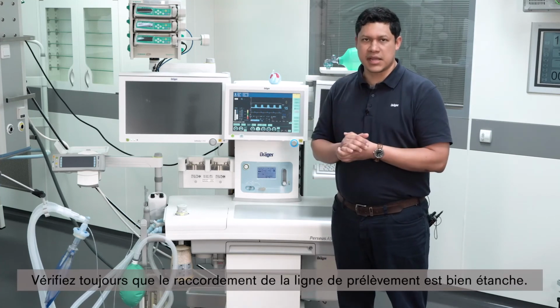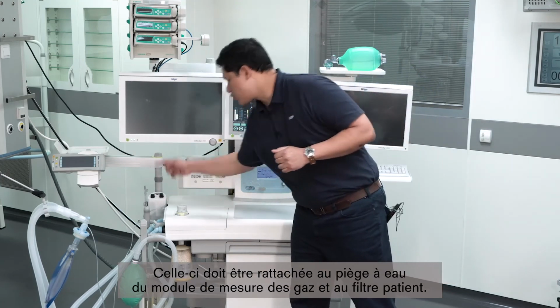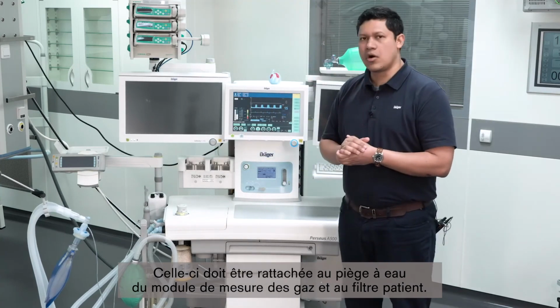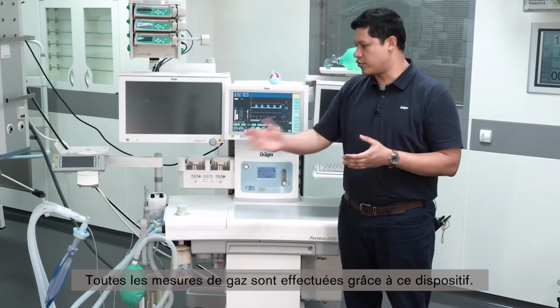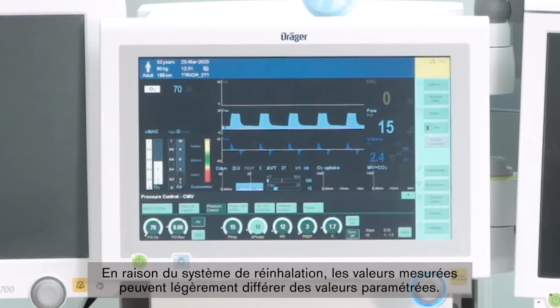Always check the tight connection of the sample line. This should be attached to the gas measurement water trap and to the patient filter. All gas measurements are done through this system. You have to constantly visually monitor the values of the FiO2 and CO2. Because of the rebreathing system, the measured values might differ slightly from the set ones.